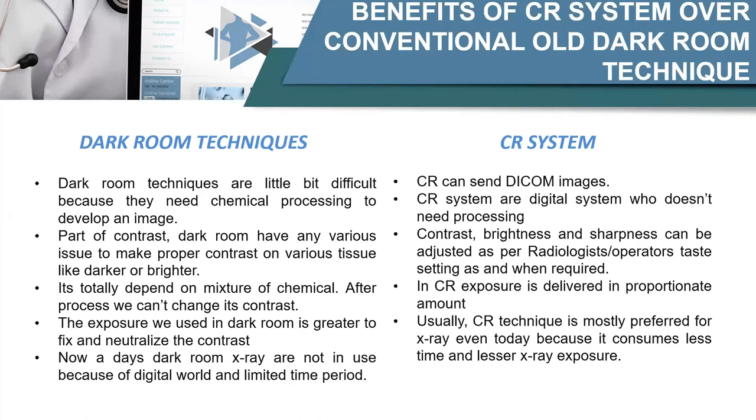Nowadays, we don't use darkroom techniques to develop an image. Usually CRs are very good, and I'm doing it for the last 3 years, and I'm getting a good workflow after using this. Next slide, please.